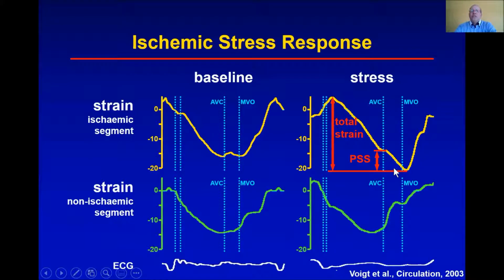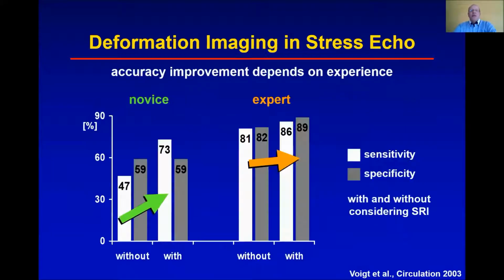And if you see such a pattern occurring during a stress test, then this is a very clear sign of an induced ischemia. This can help you to be more confident in your analysis. Although if you're an experienced stress echocardiographist, then you probably will not gain too much from that.